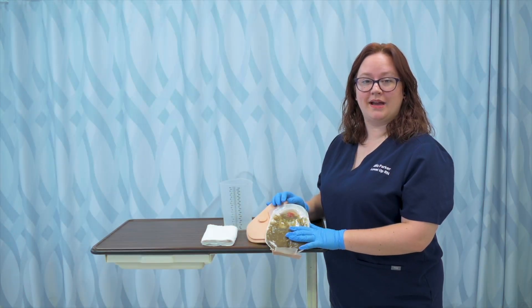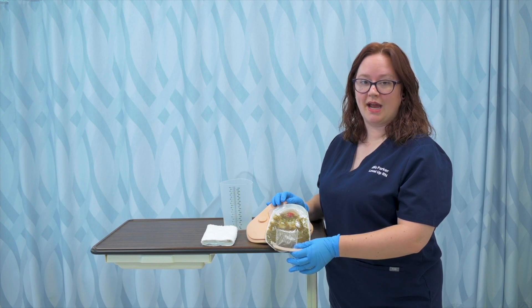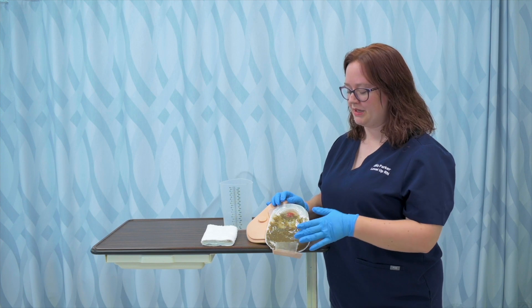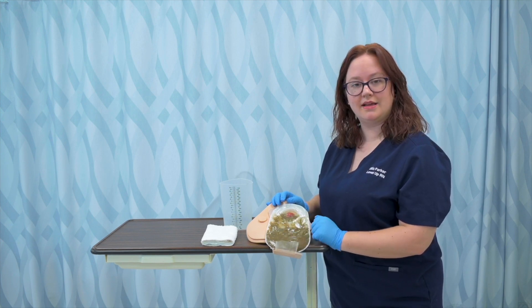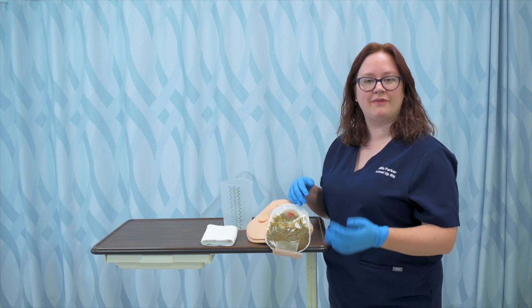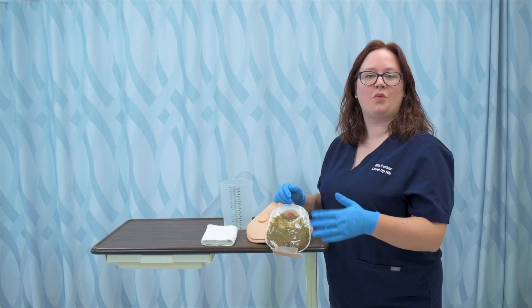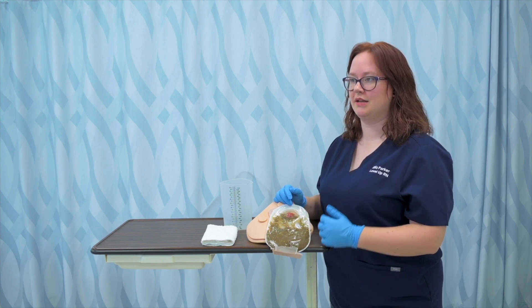Emptying an ostomy bag for a patient is going to need to be done before it reaches one half full. We want to do it at a third to a half full because the more effluent or waste that is in the bag, the heavier it gets and the more likely it is to either detach from the wafer or even just come open. And we don't want any of that effluent or waste draining anywhere and causing an issue.